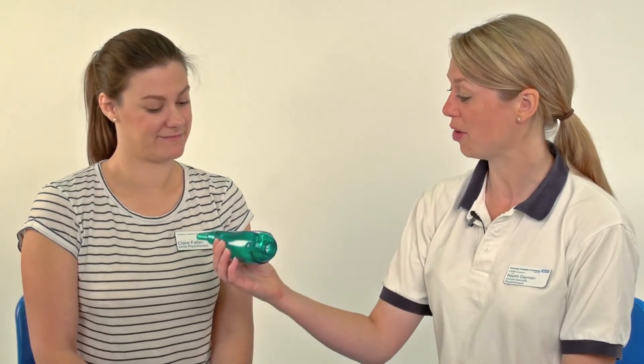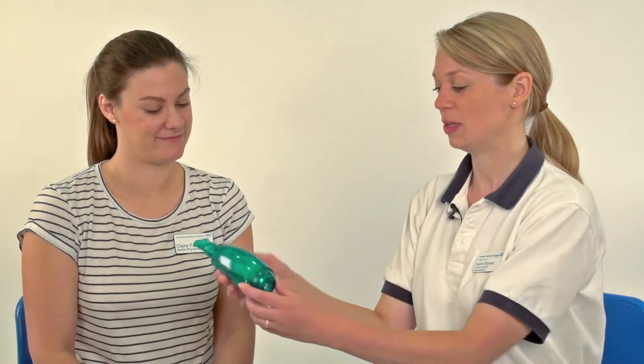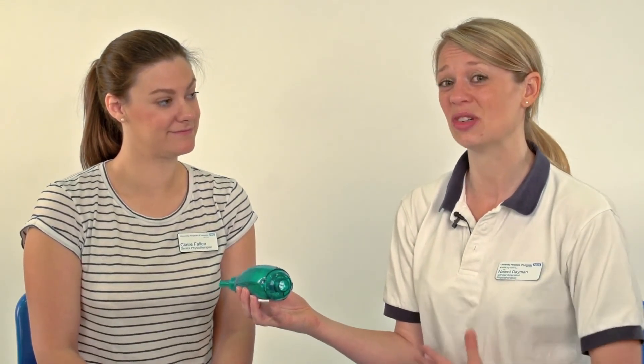Do I have to sit up when I do it? Not always — it can be done in other positions. Ideally we don't want you lying flat on your back, but you could do it lying on your side in a more upright, crooked position. You can actually do it with the Acapella upside down as well and it will still work. So if you're a parent and your child is tipping it upside down, that doesn't matter — it still works just as effectively. We normally teach it this way up but it can be done the other way. Lying down isn't ideal because it's harder to clear your chest and take a big breath for huffing and coughing, but lying on your side is fine.